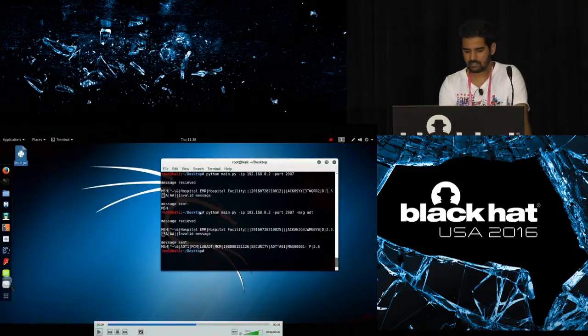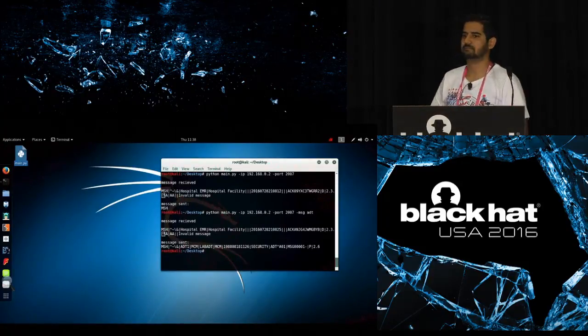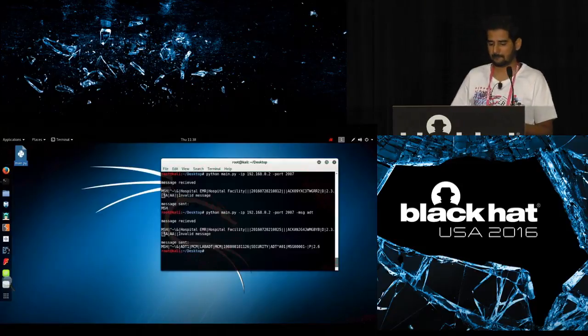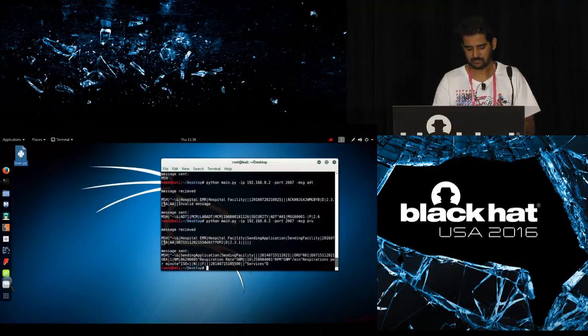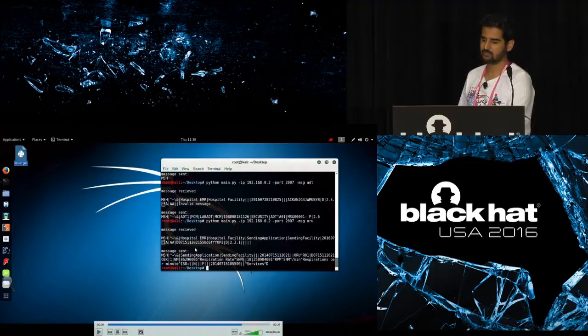Again, I got an invalid message. So when you're pen testing live systems, this will happen. All right. Because it is listening for a particular profile, I send the ORU message, and now I got it. If you look over here, it says an acknowledgement.